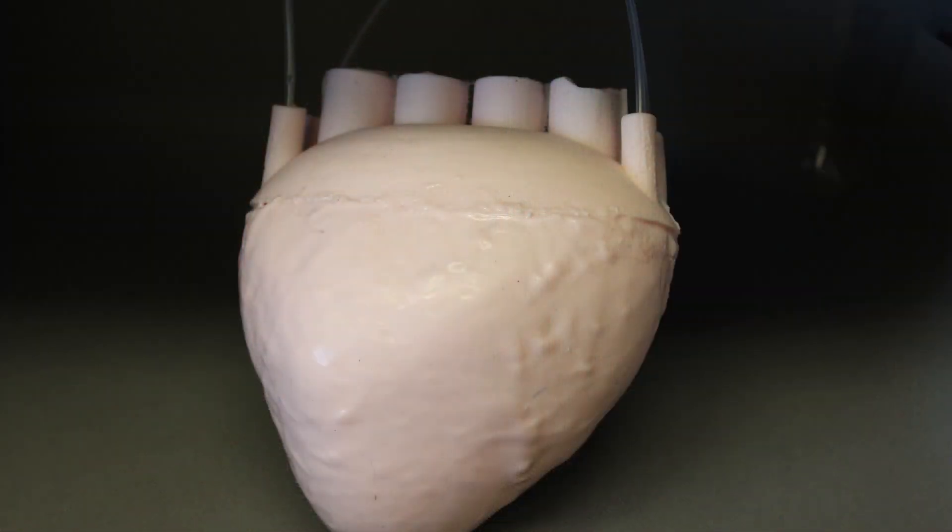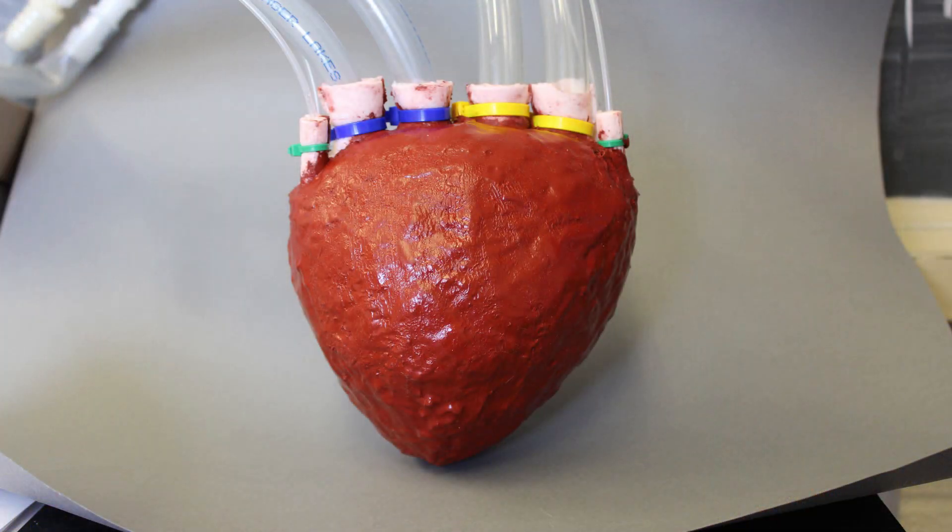What we use is a 3D printer to print a mold that we can use over and over again. And then we cast our material into this mold using a cheap, low-cost process that we can do over and over again to iterate our designs. So we can go through many different shapes and styles to try to arrive at an optimal geometry for a pump.